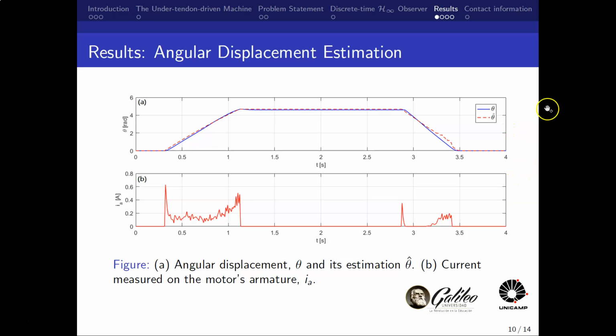One can notice the closing, resting, and opening process estimated from the current measured from the motor's armature with the on-chip analog to digital converter. On the upper graph, one can also notice the efficiency of the model to handle the noise component of the current, as well as the deviation from its ground truth that is not too significant to affect the behavior of the fingers.